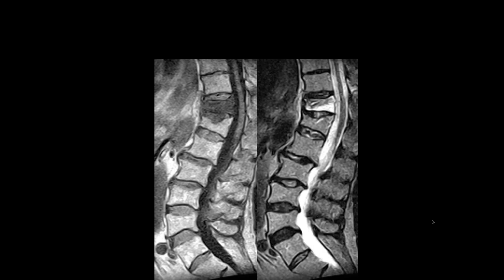Thomas: sagittal view of the thoracolumbar spine showing compression of the T11 vertebral body with diffuse edema — a typical compression fracture. The mechanism is probably forward flexion and compression. You have to check to make sure the posterior elements are intact; most of the time in this kind of injury they are, but you must check. In auto accident patients with osteoporotic spines, fractures near the seat belt level are often called chance fractures — you must confirm there are no posterior element fractures which would make it unstable.